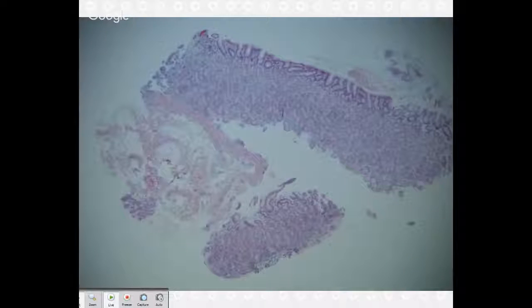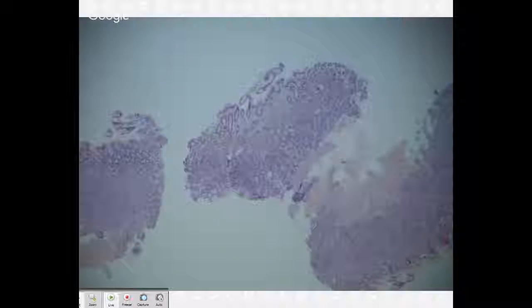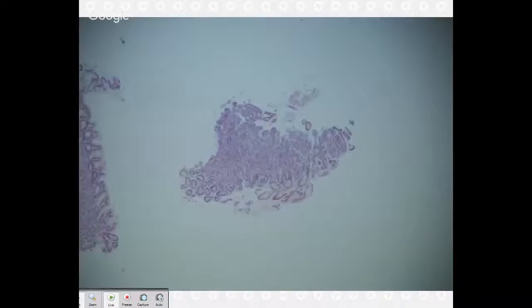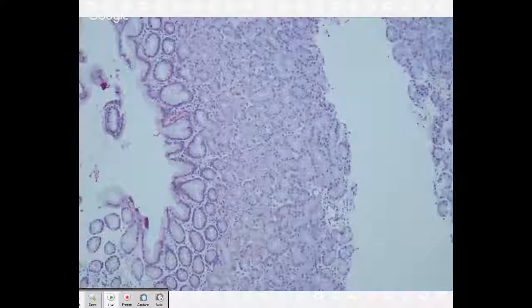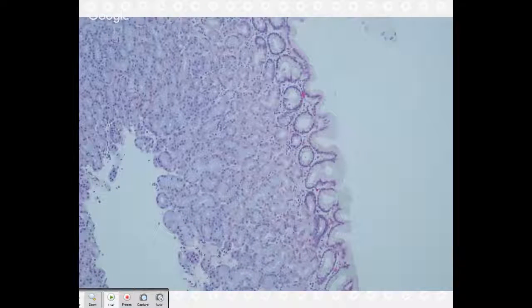Okay, so this is number 6. This is a 35-year-old woman with breast cancer. Oh, this is a good case. Okay, I haven't looked at these slides in a while, so who would like to tell me what we have here? Anybody can describe what we are seeing in this particular field.